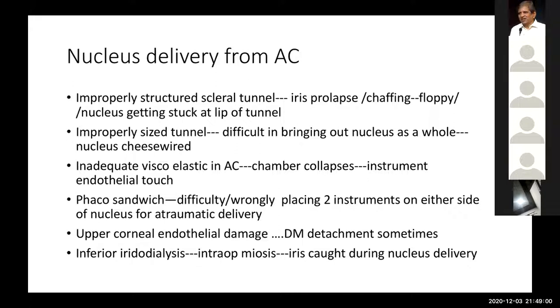That is one important thing which everybody has to do. Now coming to the main technique, I think phaco sandwich is one of the most commonly taught modes of nucleus delivery. This has been popularized by Peter Kansas, and this is a wonderful technique for an incision between almost 4.5 to 7 millimeter. This is a very beautiful technique. Any type of nucleus you can just bring out atraumatically from the eye.